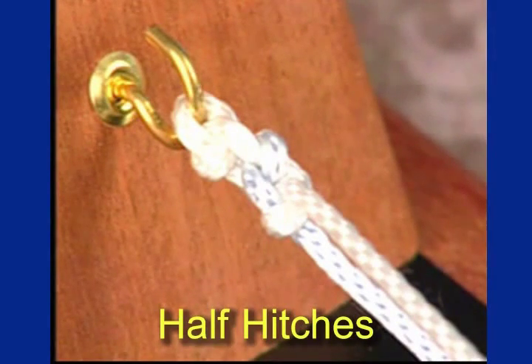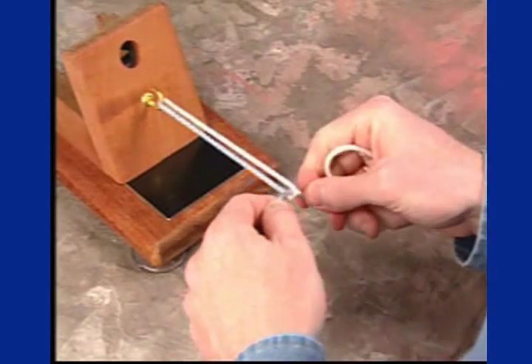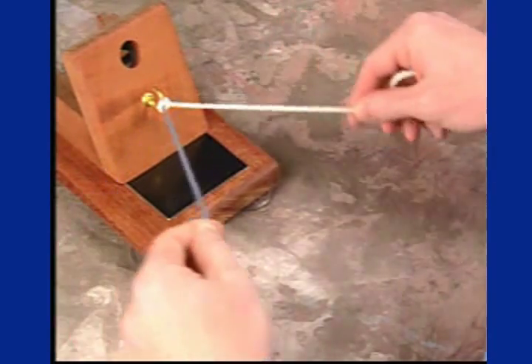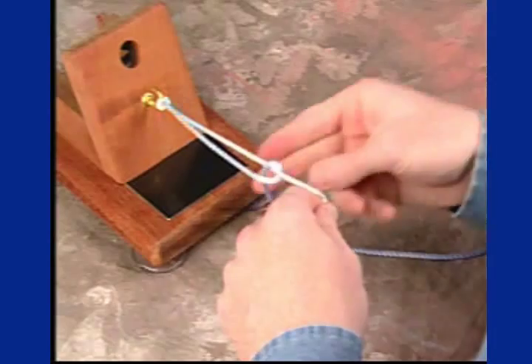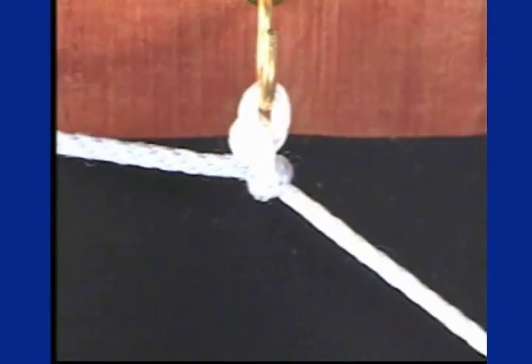This is a demonstration of the alternating half hitches. These are very important in knot tying. First of all, a half hitch is thrown either overhand or underhand, depending on the knot. Subsequently, an alternating half hitch on an alternating post is done and slid down in the joint, securing against the first.